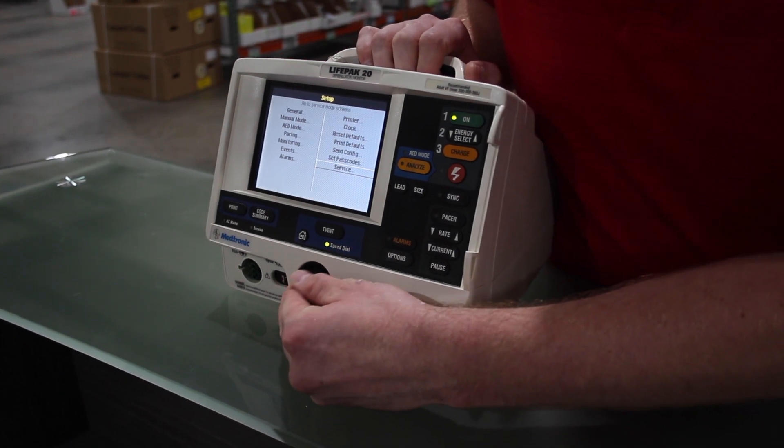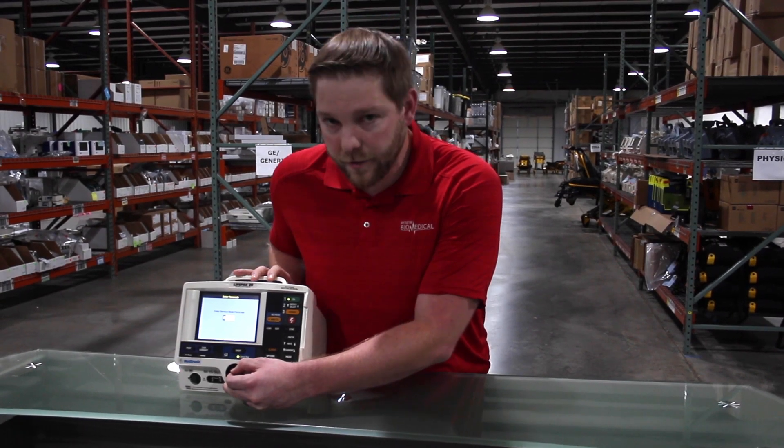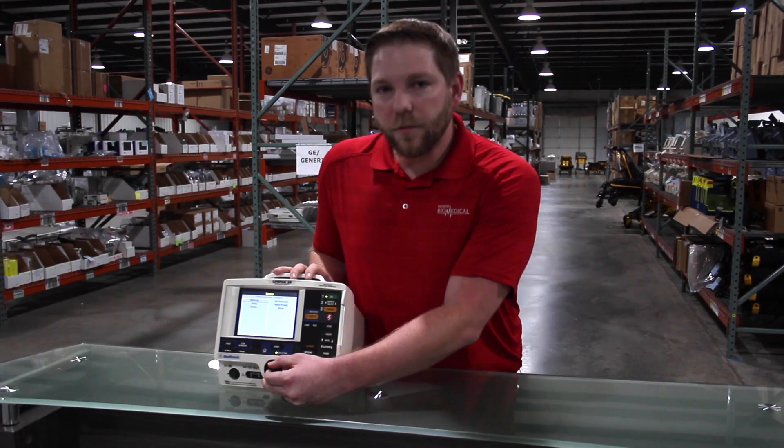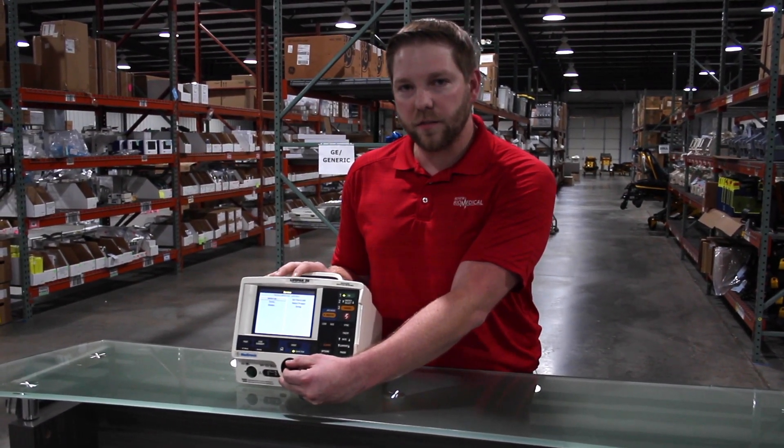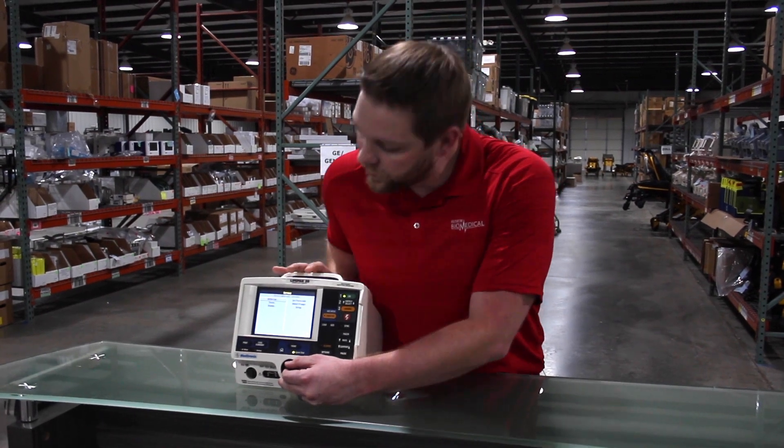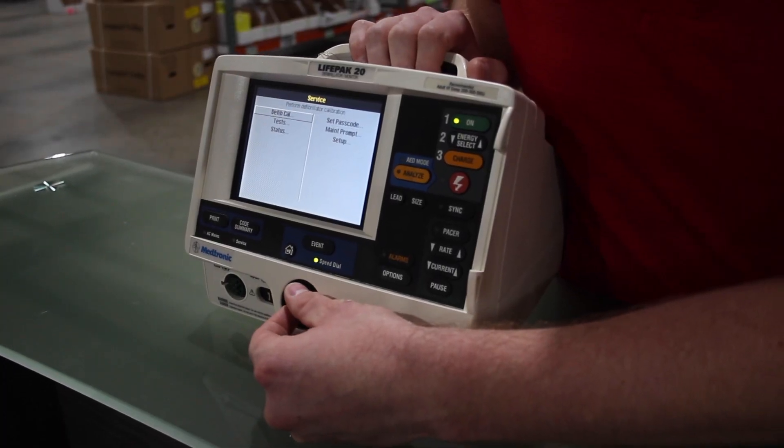Again, I set all passwords to zero, but your facility may have different passwords. Here you'll find your defib test. This will calibrate defib at 10 and 360 joules to verify it's working operationally. From there, scroll down to test.